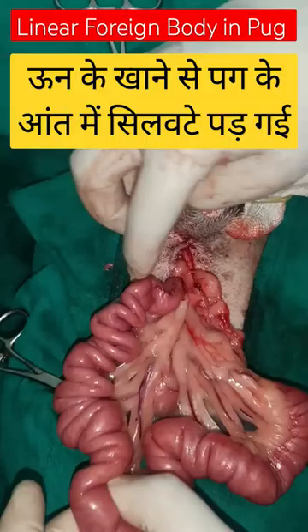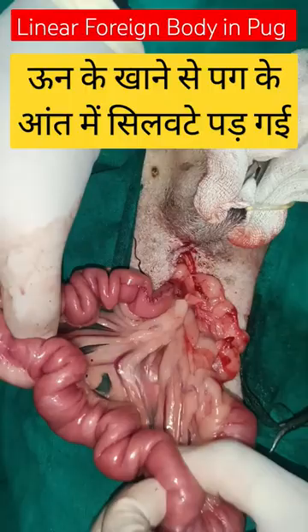You can see this is the plication — this is the typical plication seen in a case of linear foreign body. If you see this type of plication after laparotomy, it means there is a linear foreign body present.